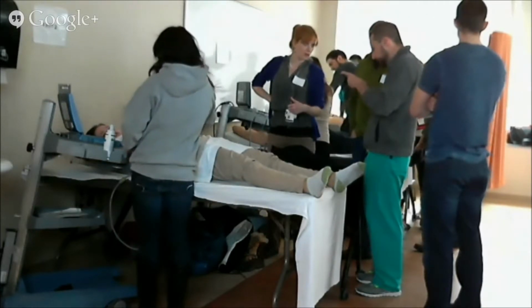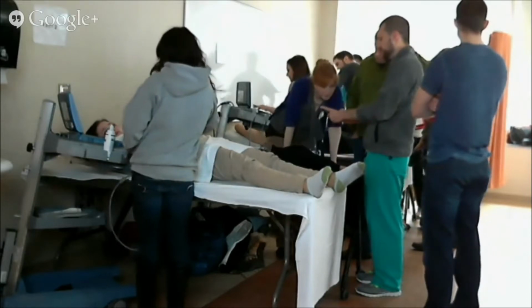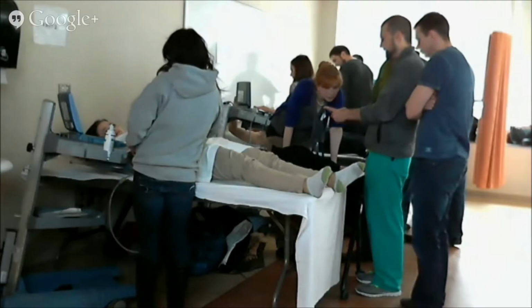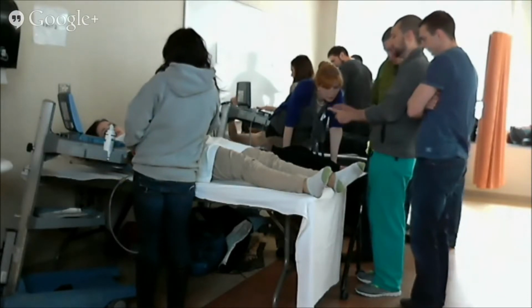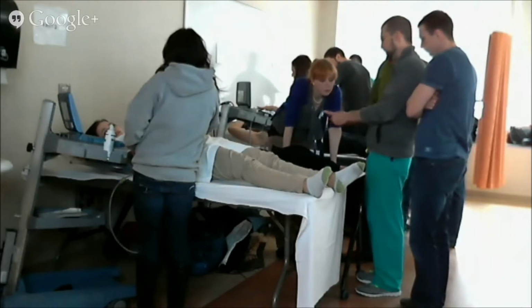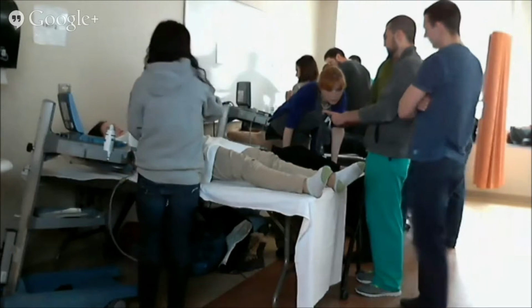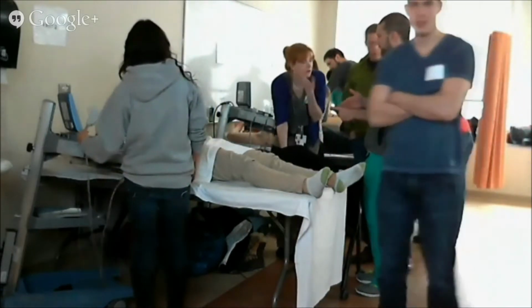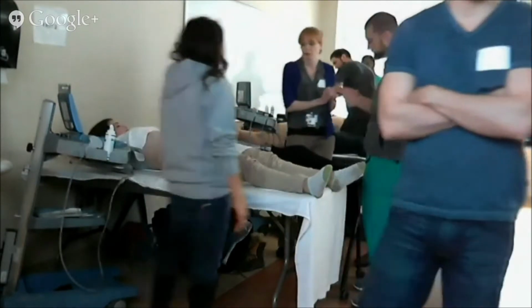What a real positive looks like: you see how it's almost like a sharper angle, whereas the seminal vesicles kind of blunt. The big thing a lot of schools teach is blunting of sharp corners. That's when you can get tipped off. It's like looking for blood in the brain. Yeah, exactly.